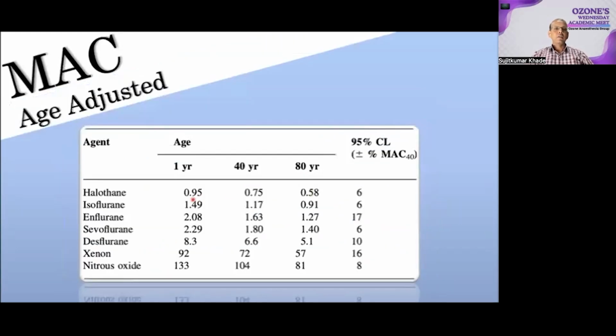You can see here, the pediatric patients require high end-tidal anesthesia gas concentrations to have a MAC of 1. As age progresses, lower end-tidal anesthesia gas concentrations are required for maintaining a MAC of 1. Here, I would like you to note that if you don't enter the age of the patient on the monitor, then the MAC shown on the monitor will be for the age of 40 years. So irrespective of the patient's age, if you don't enter the demographic data of the patient on the monitor, then the MAC displayed on the monitor will be for the age of 40 years.